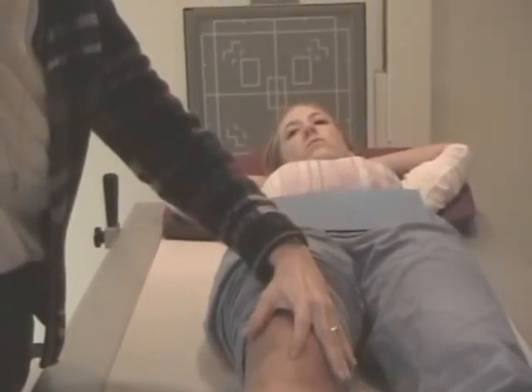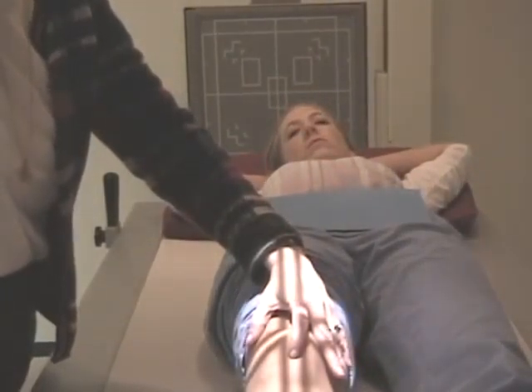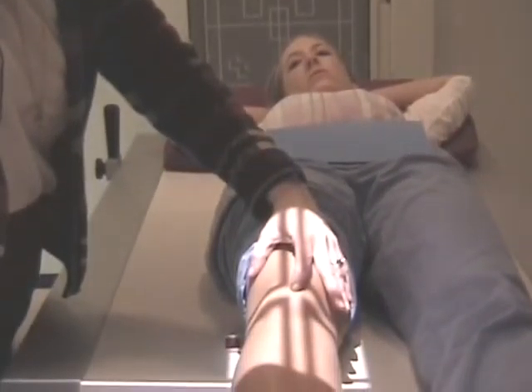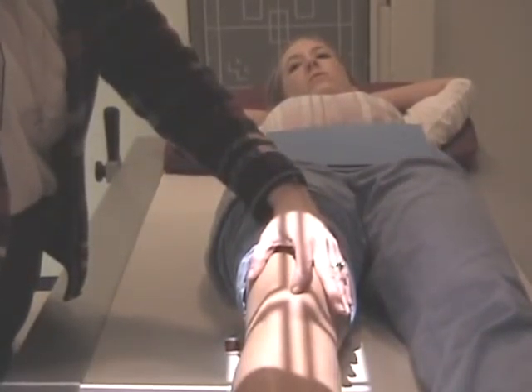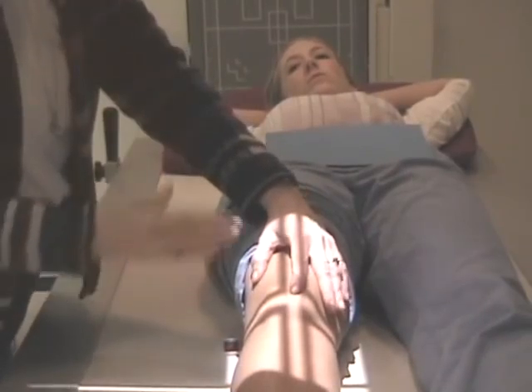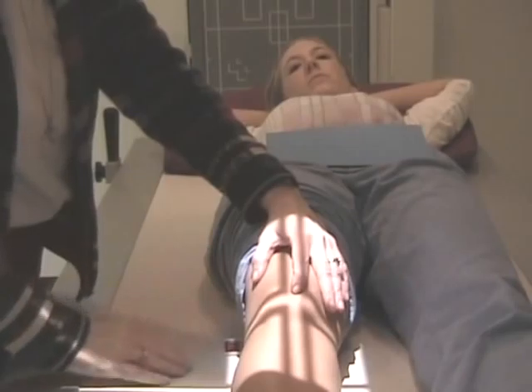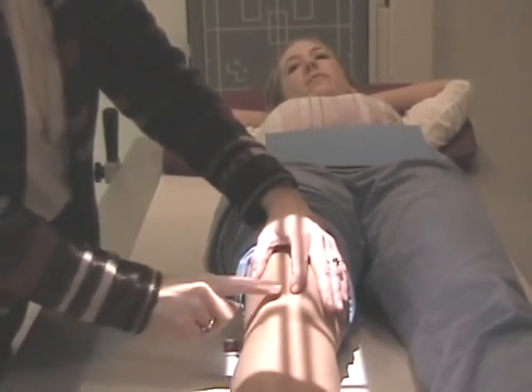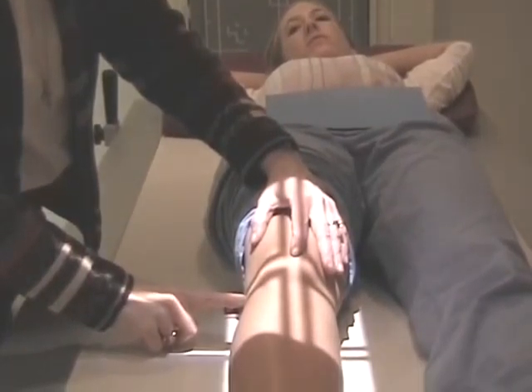Here's the apex of the patella, and normally you would enter 1/2 inch below that. Well, when you have a tube angle, instead of 1/2 inch below that, you might be, say, 3/4 inch. You have to shift your entrance point just a little bit, so when it goes to the center of the leg, you're actually at the true point of the joint.